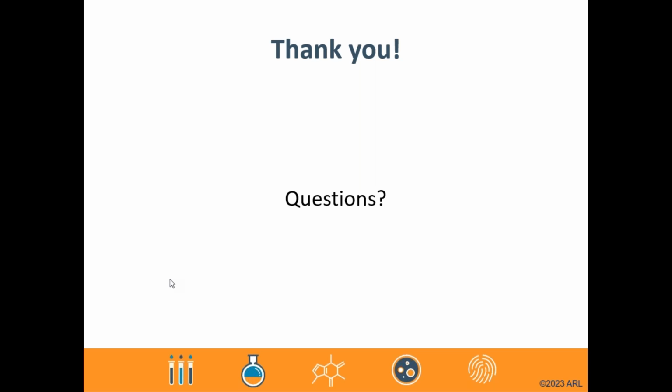So getting ready for the new rules, I assume that means the updated 797. Will rapid test results be accepted? So again, 797, even the current version, as well as the one to be official in November, mentioned that for any product that needs to have sterility testing performed, that should be done by USP 71 or a validated alternative method. And that's where that references USP 1223, which gives direction on how to validate different methods.